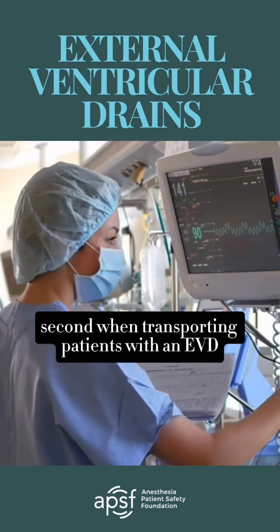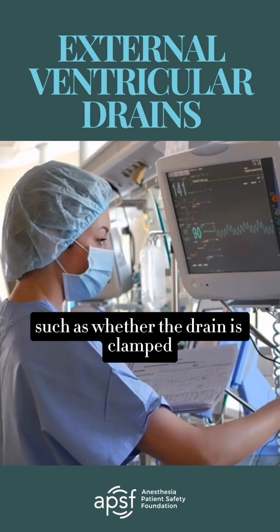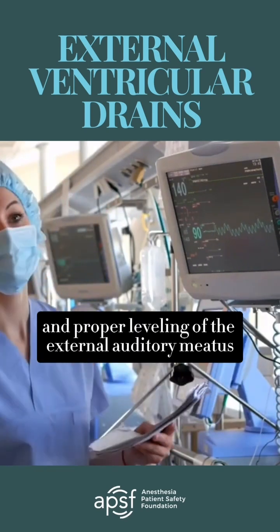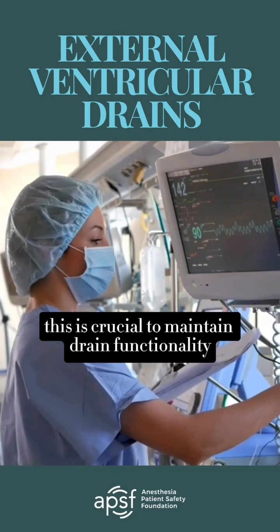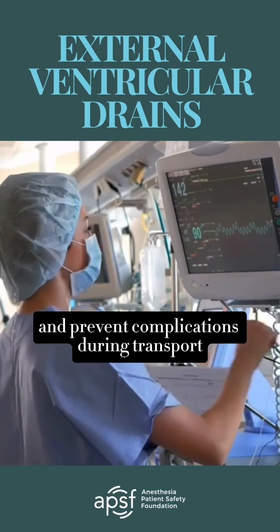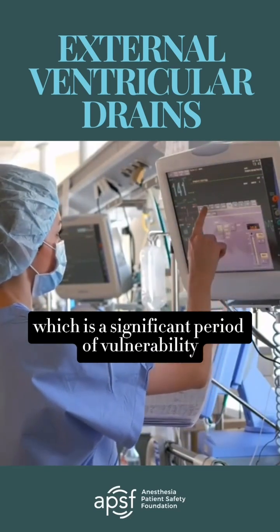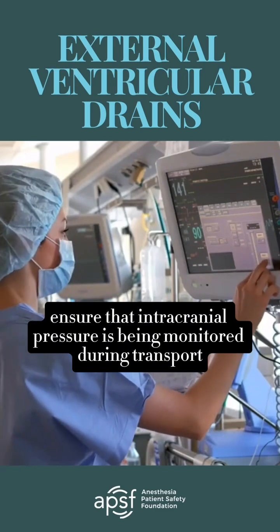Second, when transporting patients with an EVD, certain measures should be assessed, such as whether the drain is clamped, head of bed elevation, and proper leveling of the external auditory meatus. This is crucial to maintain drain functionality and prevent complications during transport, which is a significant period of vulnerability. Also ensure that intracranial pressure is being monitored during transport.